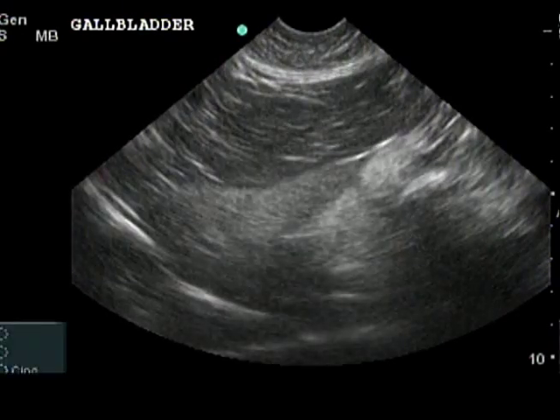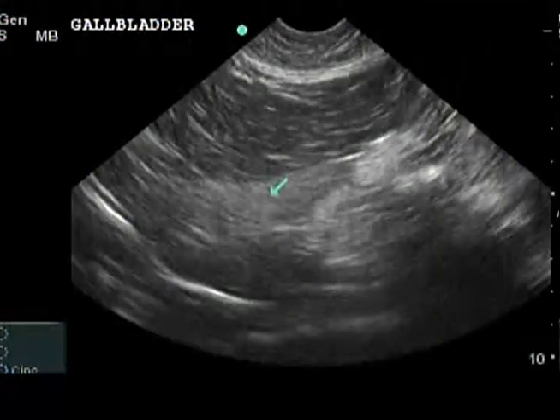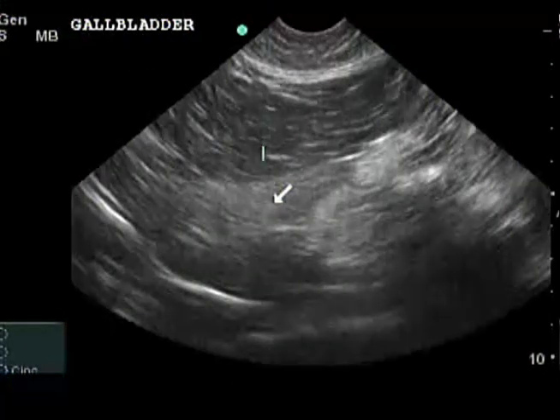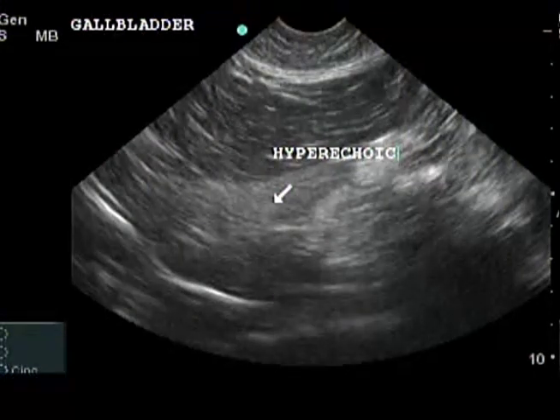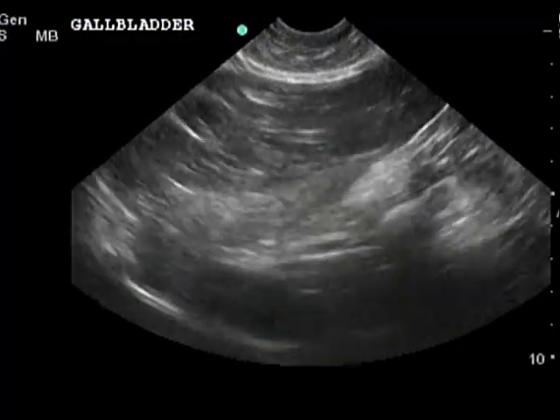In general, all normal appearances for dogs also apply to cats. However, cats can also store fat in the liver just as they store fat in the tubules of the renal cortex. So, a hyperechoic liver parenchyma in an older obese cat with no symptoms could be normal. In this video, note the thickness of the falciform fat in this 24-pound cat. Also note that the liver is hyperechoic compared to the fat.